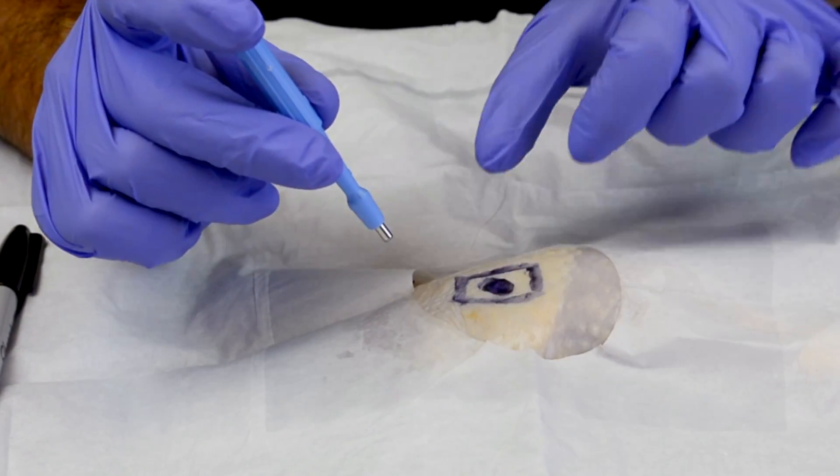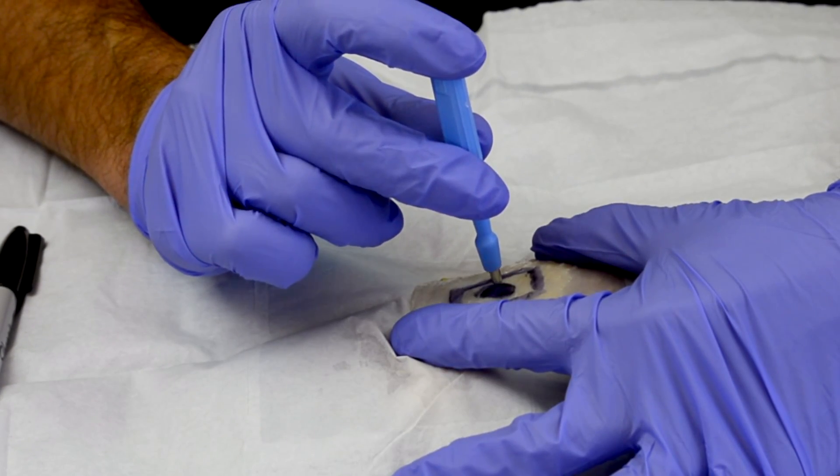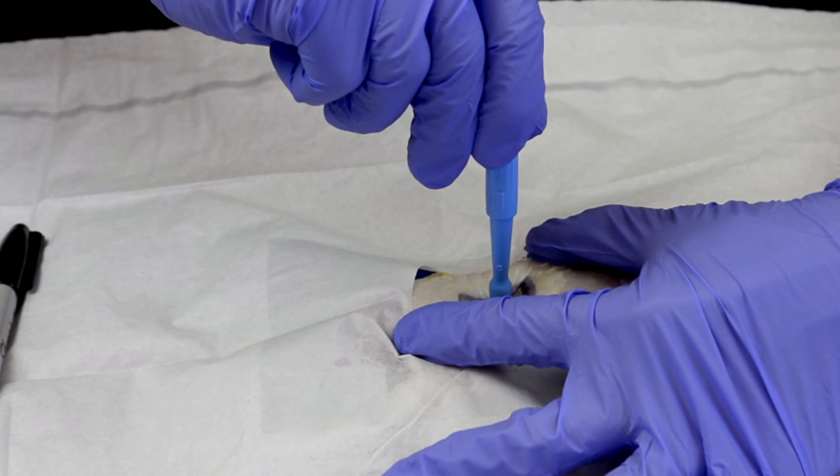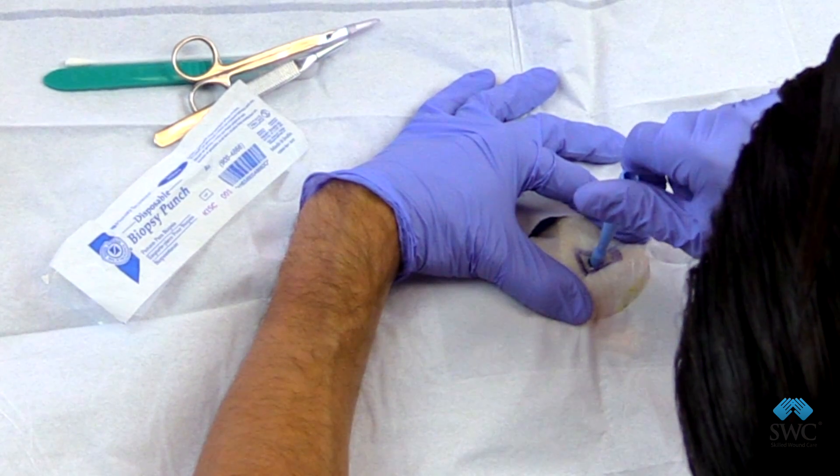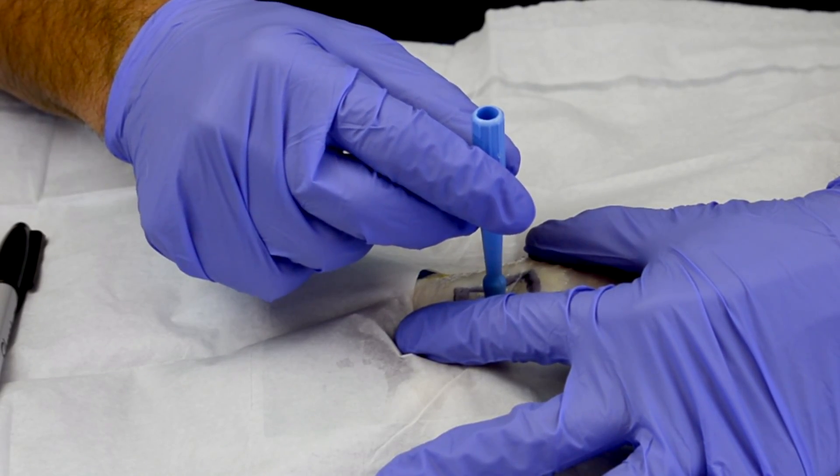I'm going to hold the tissue taut. That will make it easier. You will be using a circular motion. I'm going to be going in and going clockwise, and then you're going to get your actual tissue in the head of the punch biopsy.